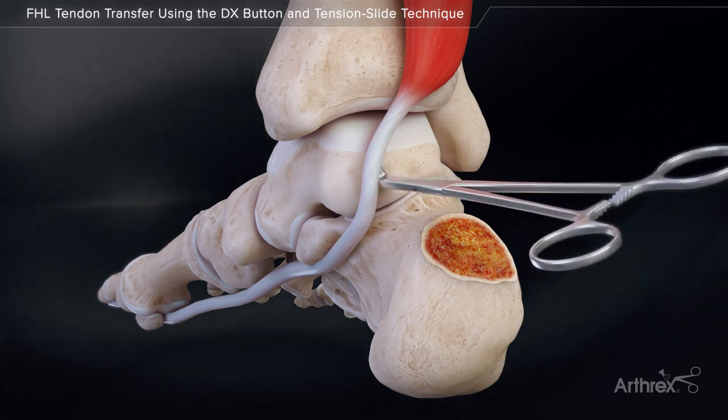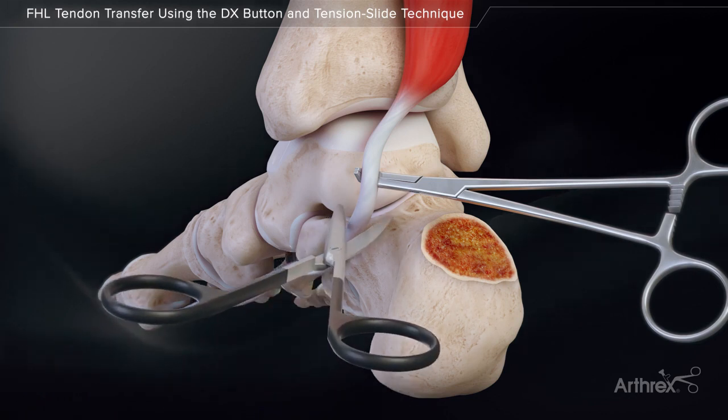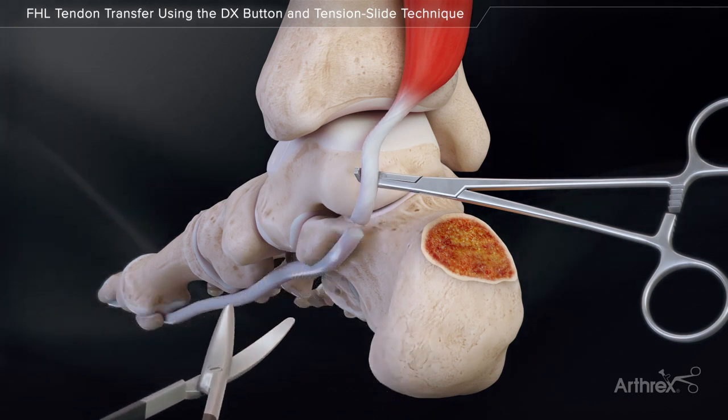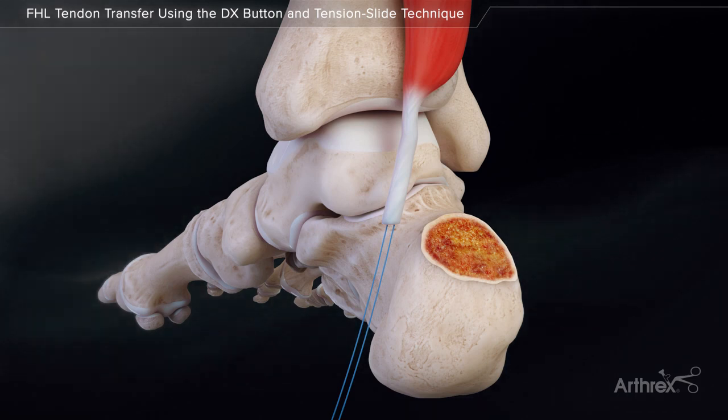Confirm by flexion and extension of the hallux. Retract the neurovascular bundle and expose the tendon. Then cut the FHL as distal as possible. Place a traction stitch through the tendon using a number 2 fiber loop suture.